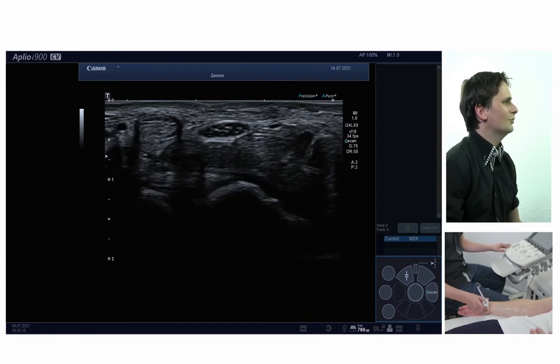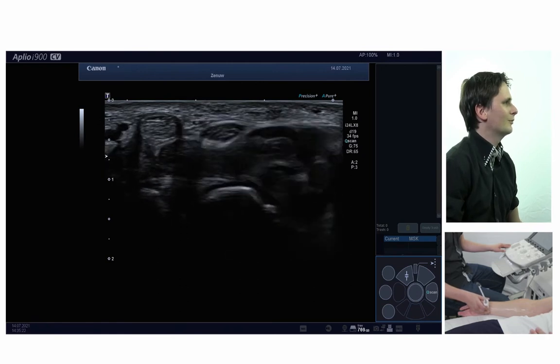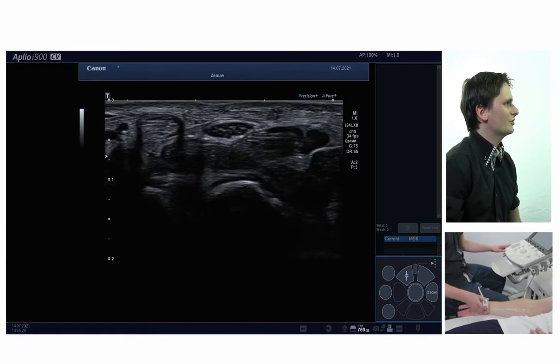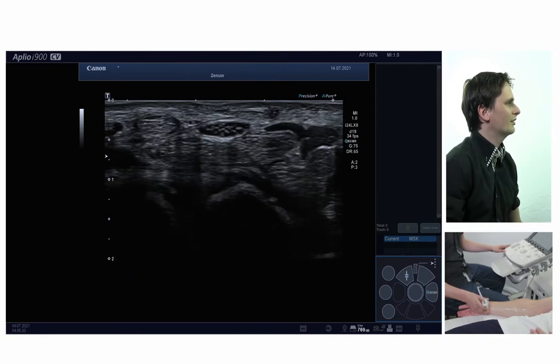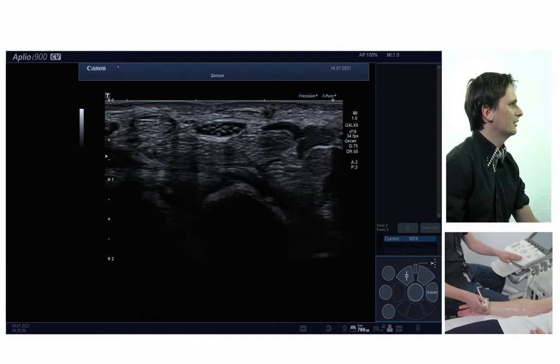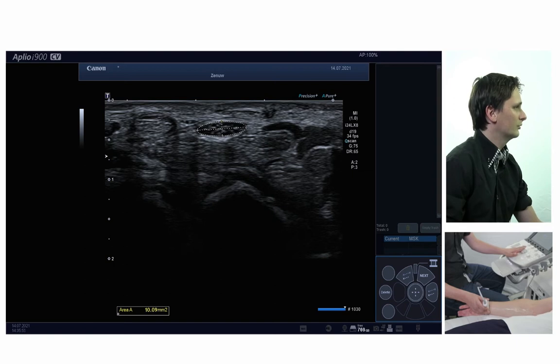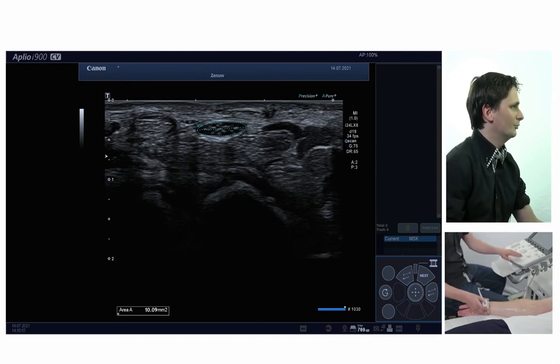You can also ask the patient to move their fingers, and you can see the tendons move while the nerve remains nicely in its original position. It's important to keep the probe perpendicular to the nerve to obtain an optimal image so you can evaluate the fascicles very nicely. I'll perform a measurement now within the hyperechoic rim of the nerve. Here you can see a cross-sectional area of 10 millimeters squared — that's normal in this case.